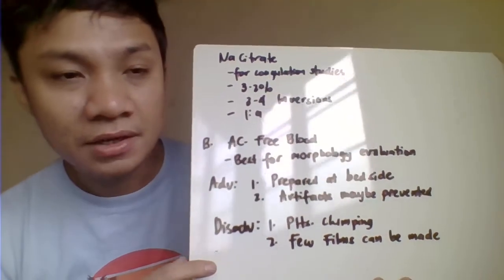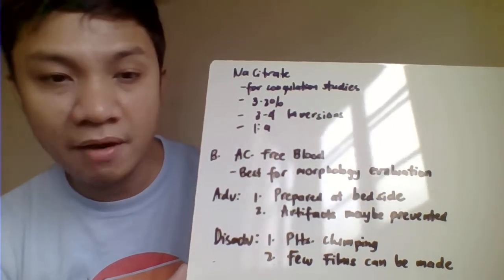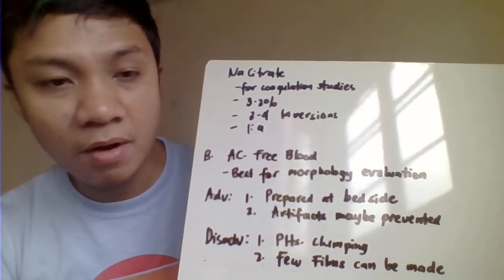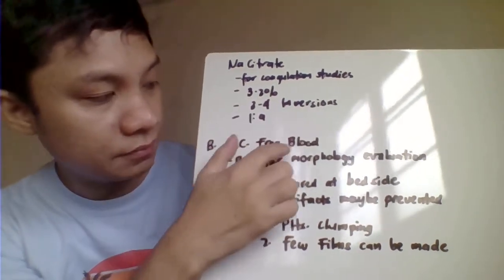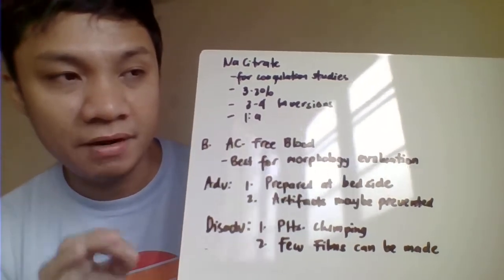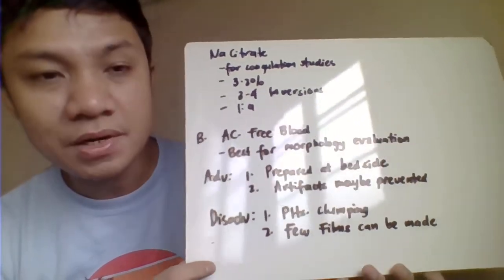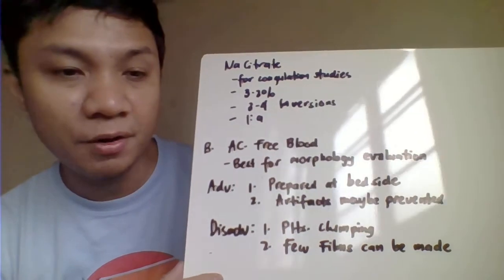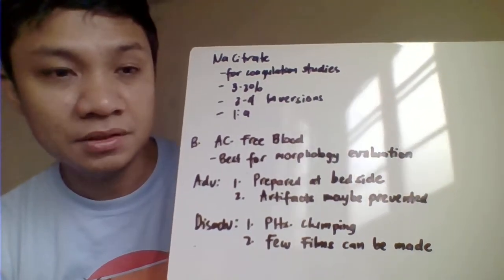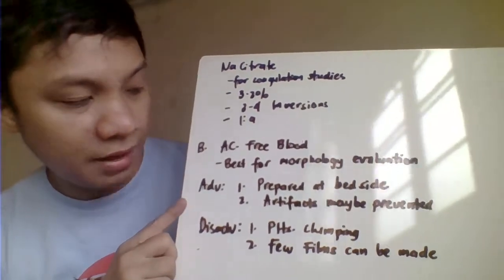Okay, another source of the blood for your blood smear preparation, we have here your anticoagulant-free blood. So, anticoagulant-free blood, okay, is the blood collected from your skin puncture or your finger prick puncture. Okay, so we consider this one as the best for your morphology evaluation because of little contamination. Okay, so we have that one as an advantage.